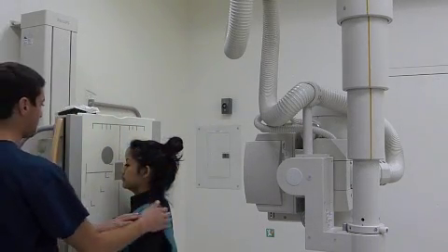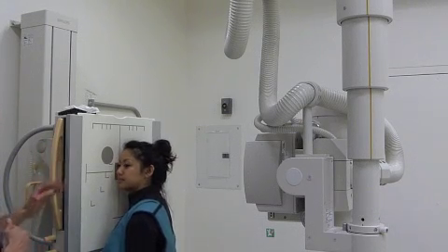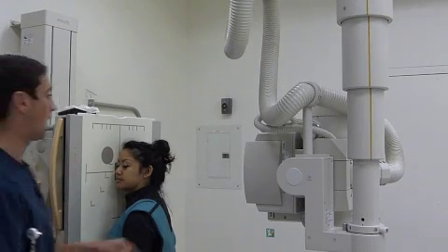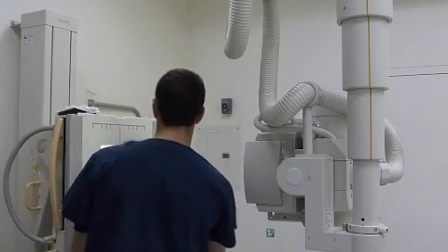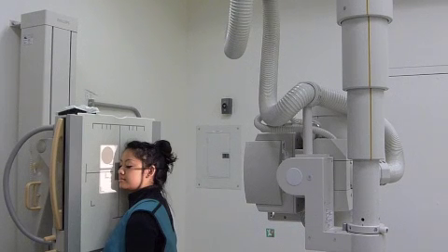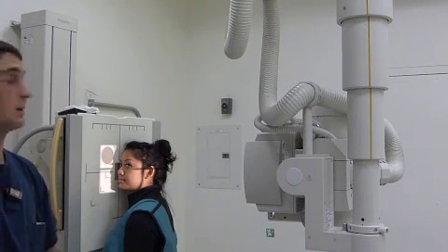with the cheek against the board and facing me this way. So I will have the mid-sagittal plane parallel with the film and the interpupillary line perpendicular with the film this way. I have my tube lined up. I will have it at central ray at 1/2 inch posterior to the outer canthus, and I have the patient shielded. And the technique I will use for this will be 75 at 20. I will now take the image.